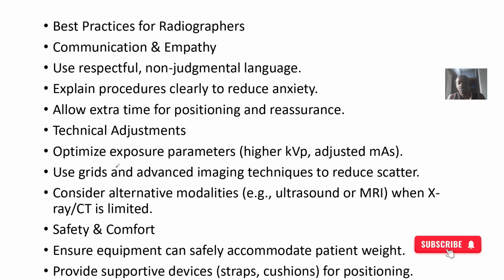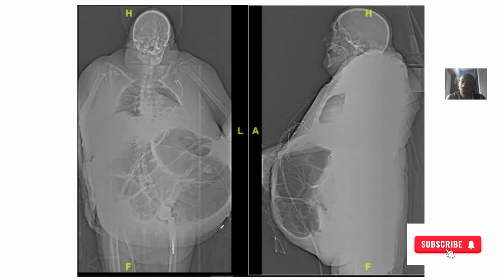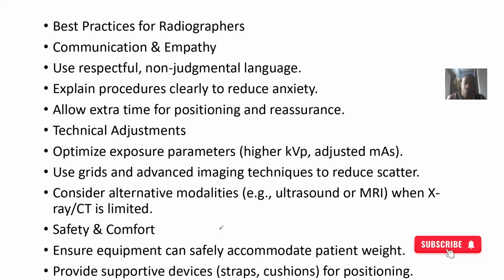So what next? Longer exposure times may be required, and this is now placing the patient at the risk of having side effects due to radiation. So patient comfort and dignity, the patient is not really comfortable too.